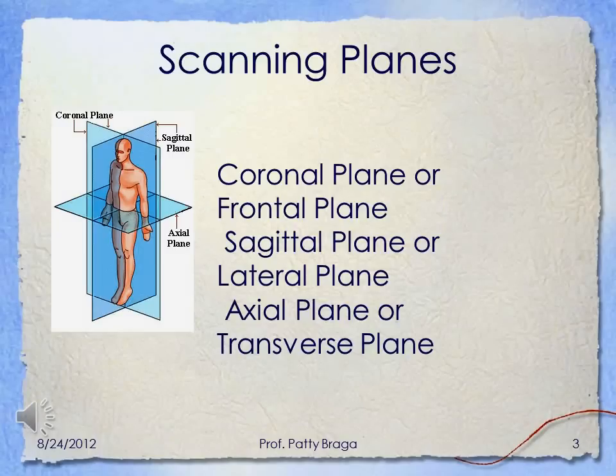Each image that we make is based on one of these scanning planes. So they are very important that you know what they are and understand how they look on the screen.